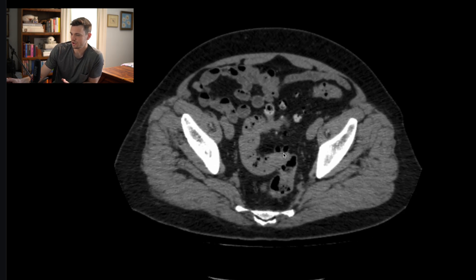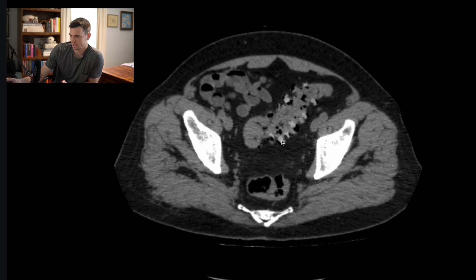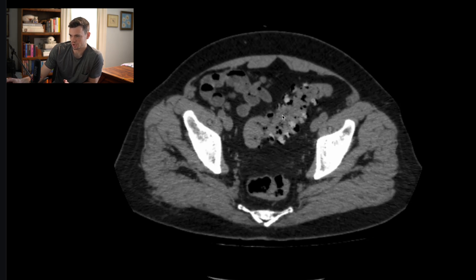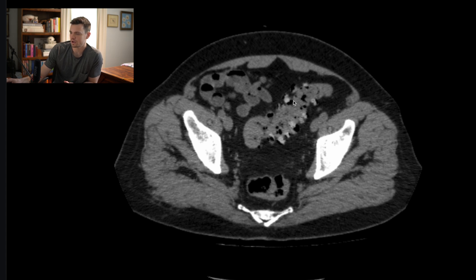I just want to show you what a diverticulum looks like. I'm going to stop on this slice of the sigmoid colon, and I want you to look at the margin of the colonic wall — it's not smooth. There are all these little tiny outpouchings, and I'm tracing them with my mouse. These outpouchings form in areas of inherent weakness of the colonic wall, thought to occur at the places where the penetrating vessels of the colonic wall are traversing. That's where these things end up developing.